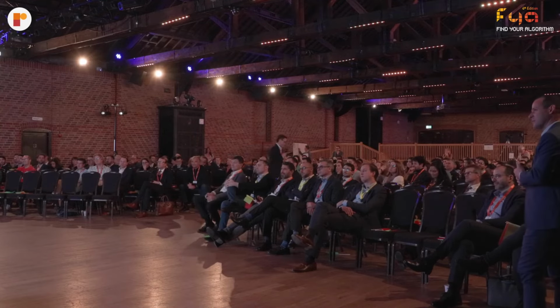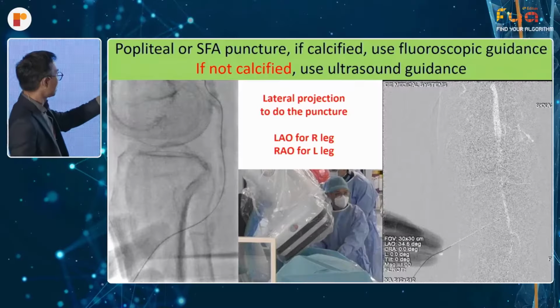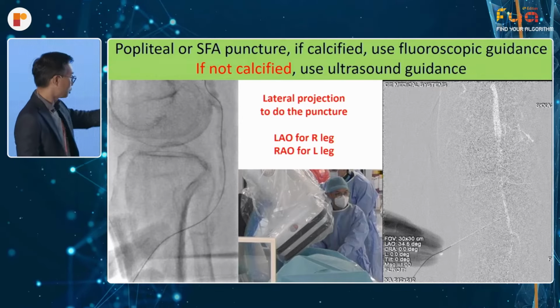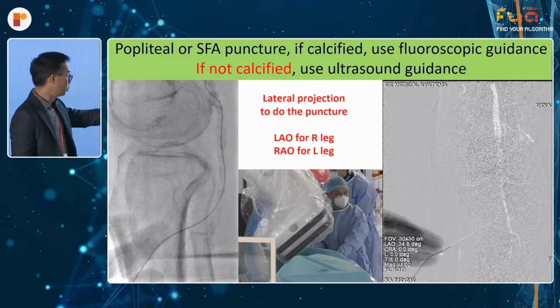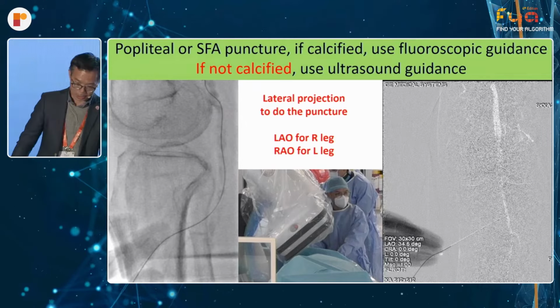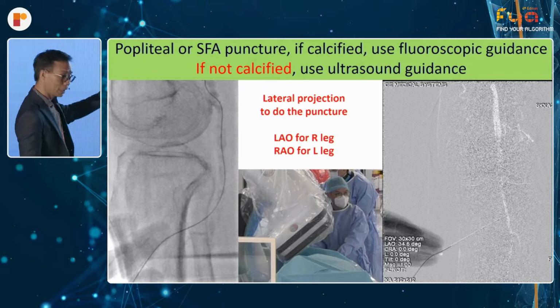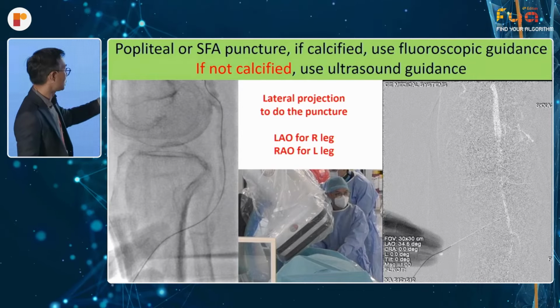The important thing is the projection. That's why I was making a point of it, that the projection is important. For the right leg, use LAO. For the left leg, use RAO. That's the only way you're going to get room. Position the leg a little bit bent like that, and from there you can get a nice view and a nice puncture into the P3 popliteal.